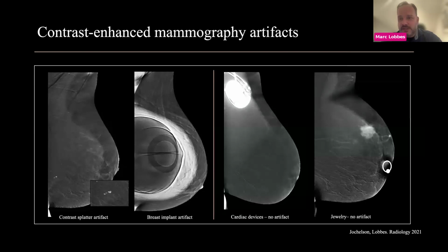And remember, we still have MRI. It's not forbidden to do MRI. And I think the benefit of doing MRI with women with breast implant is much bigger than doing it with contrast-enhanced mammography. On the other hand, we have some things sometimes inside our body that is not allowed to be easily entered in the MRI.